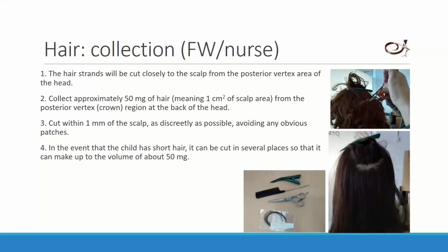Okay, and if the child or the adolescent has short hair, you can cut from different places. You can cut a little bit from here, a little bit from there, more or less from the same area, but you can divide it in different places. I have a comment on this.